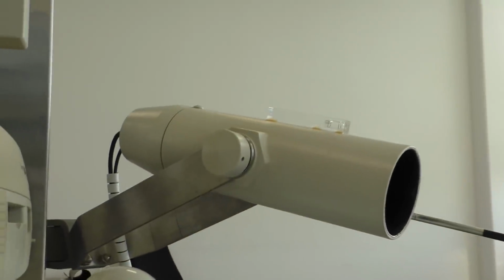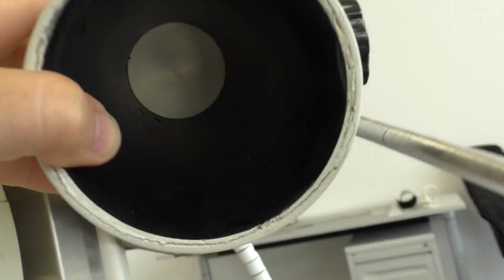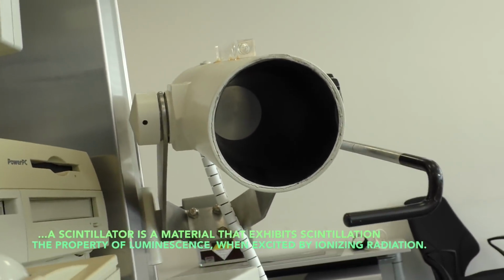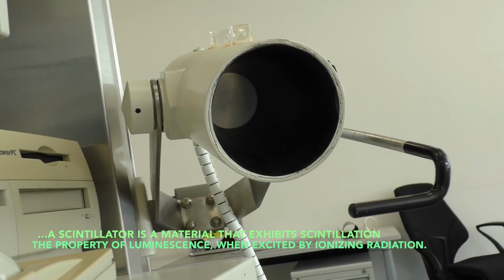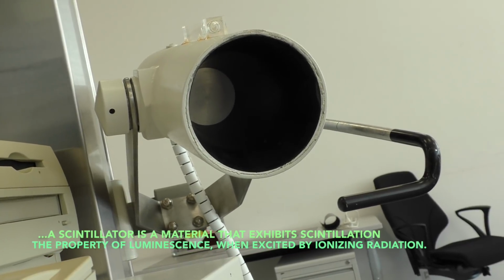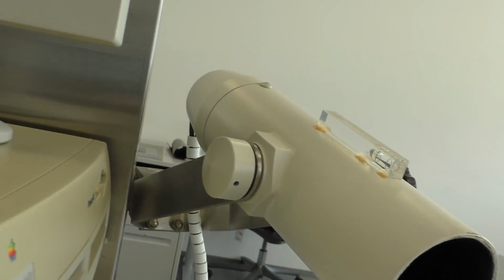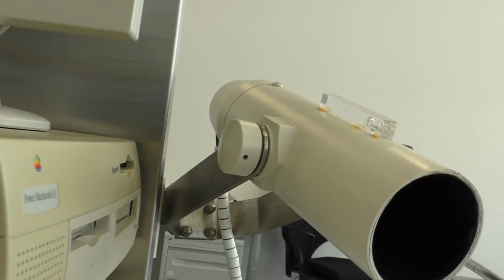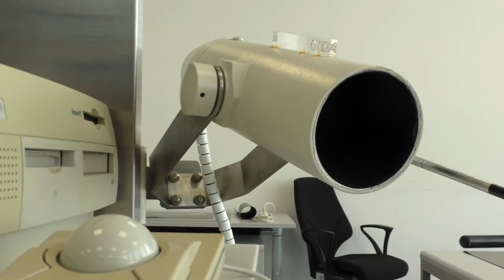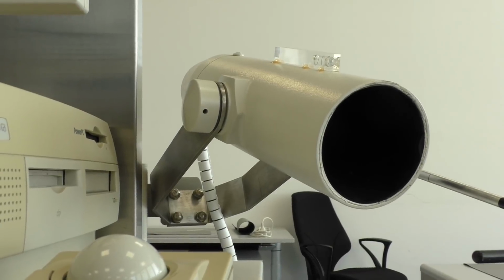So I already said that's the detector tube. It moves a little bit hard, not much to see inside. There is a scintillator material in the front. That means if it gets hit by radioactive radiation, it emits light, which is then amplified by a photodetector tube, which is in the back here. We will see that later. And the amount of light and the strength of the pulses is characteristic for the radioactive isotopes.